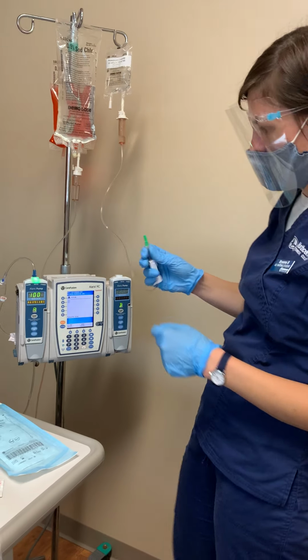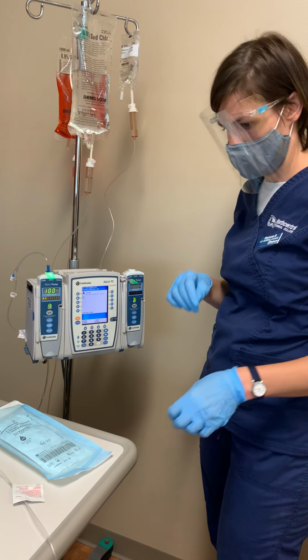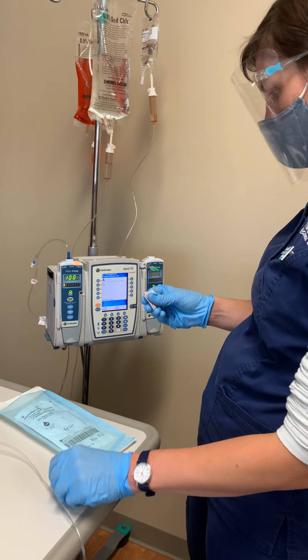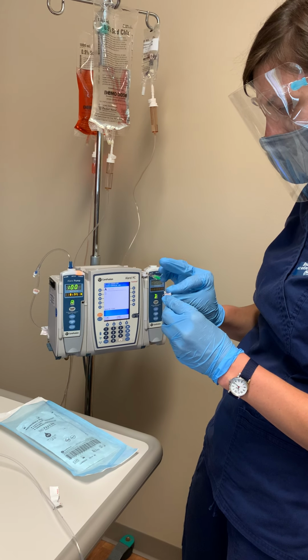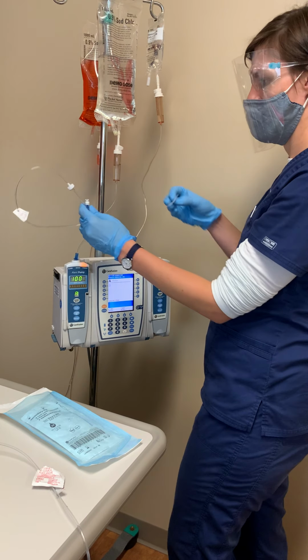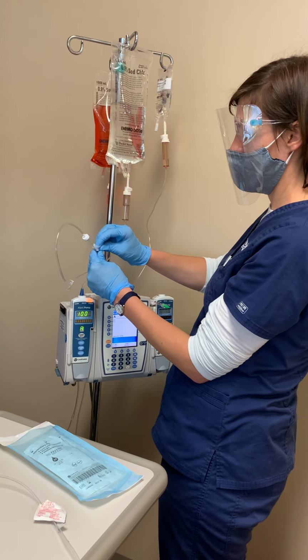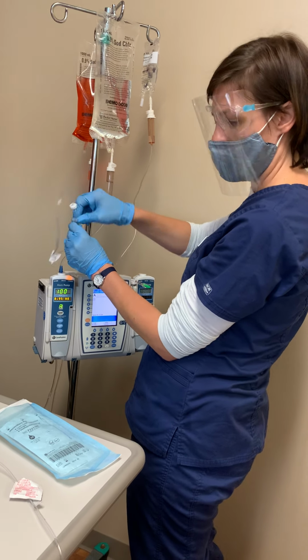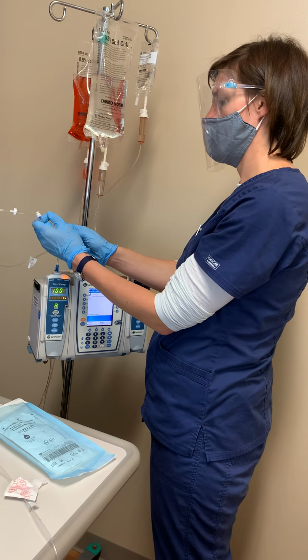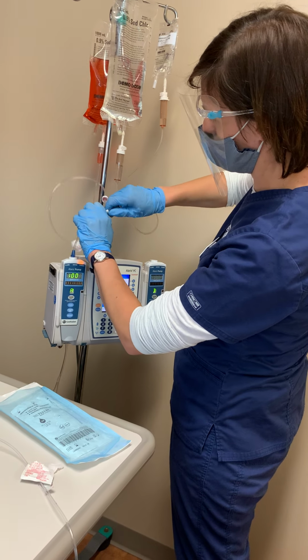Okay. Now this is still capped, so I'm just going to set it here for now. I'm going to pause this, just temporarily. Get my alcohol swab, my highest Y port. I'm going to cleanse it according to facility protocol. My facility says 15 seconds, so we'll say that that's 15 seconds. I'm letting it dry, not touching it. It's dry now, so I can connect my secondary.